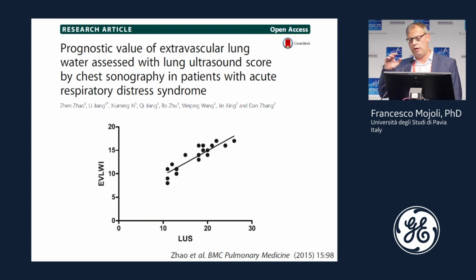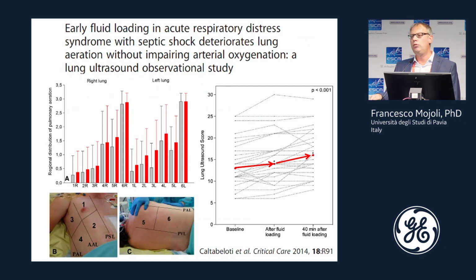Okay, because lung ultrasound is correlated with lung edema, we can use ultrasound to help us in the management of fluid loading in ARDS septic patients. In fact, ultrasound is more sensitive than oxygenation in early detection of lung worsening related to fluid loading. So we can use ultrasound to know when to stop fluid loading in this setting.